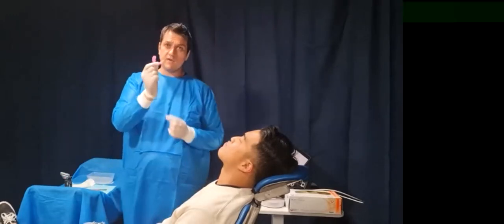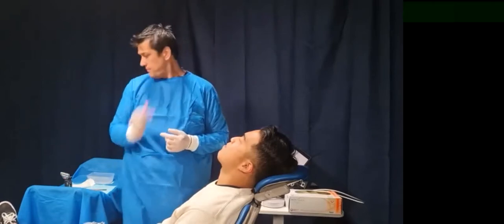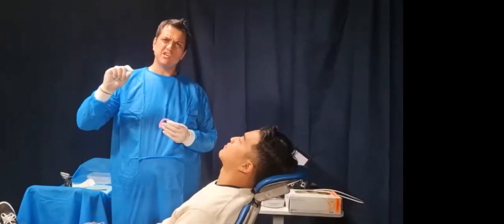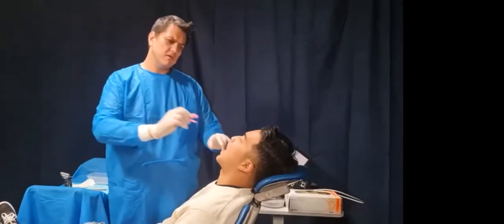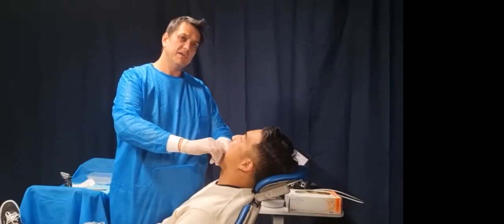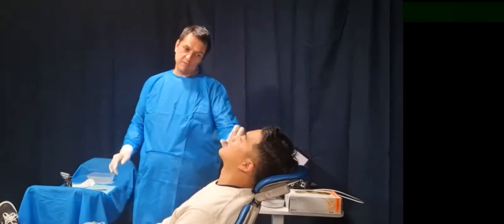Now, what I've got here is a verification of our centric position. I'll pop that in the water just for a quick tick. And what that does, it just cools off. Now you can go in and out of the mouth, check. But for this instance, we won't. I'll just pop that back in the mouth just for safekeeping while we do the next step. Now the next step, you can close together for me, thank you.